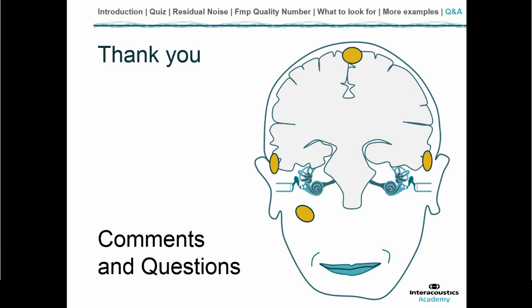Do we have solid reference for the residual noise values? I do know that the Eclipse was thoroughly tested by Guy Lightfoot from the UK, and it is in cooperation with him that we came to these recommendations. And I think that generally speaking, the UK has very good protocols and guidelines. So I can find for you the UK guidelines, and from there you can take the residual noise values also.